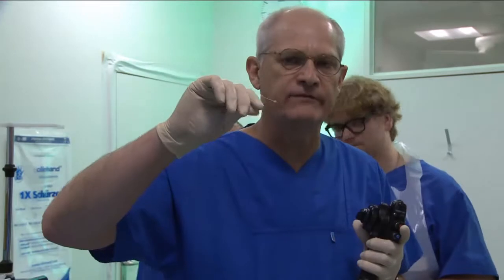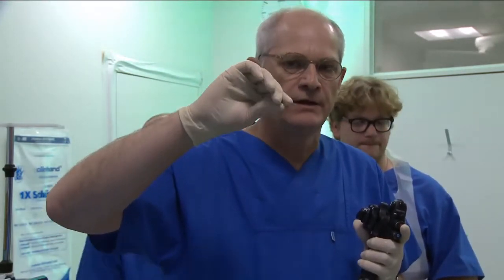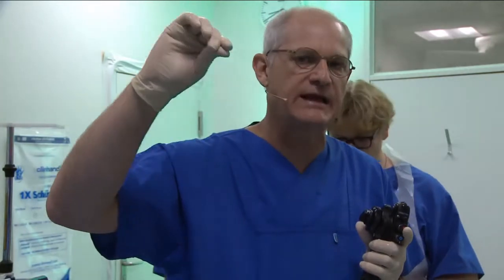And if you've ever felt it, we have a technician at my hospital now that actually can feel the slight suction pressure that pulling the stylet back creates. So I think it's the key to cytology.